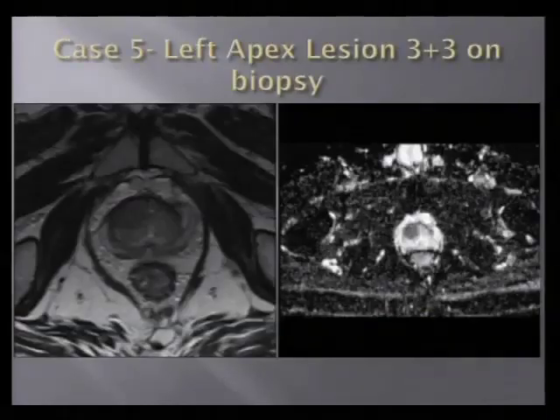Active surveillance, what that means is you're just not going to choose to have radiation therapy, you're not going to choose to have a prostatectomy, you're not going to choose to have anything other than watching the PSA and the clinical exam, assuming prostate MR is not a part of this. If someone actually chooses that, this is an example, in my opinion, where the prostate MRI might sway you a little bit more to a little bit more active management.